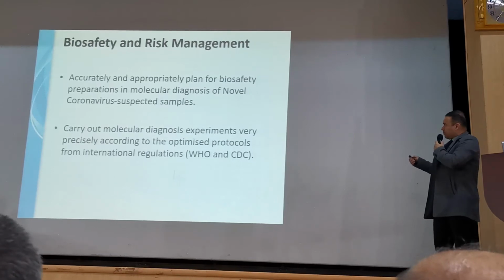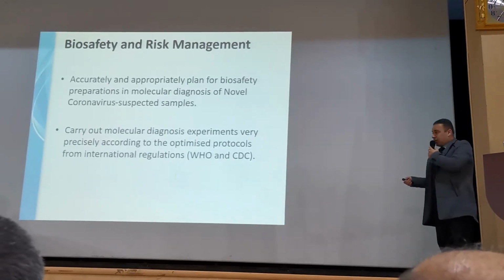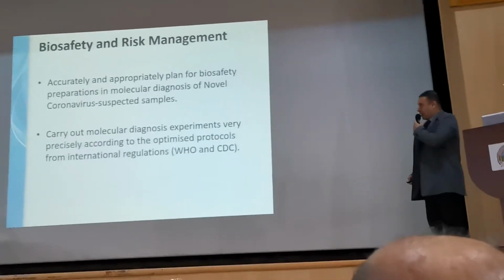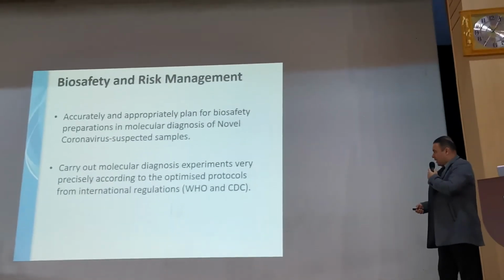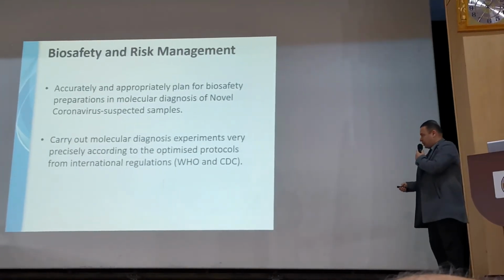I mean, for example, accurately preparing for the safety and processing of the sample inside the lab, and also doing the molecular diagnosis in a very precise way so as not to be another way for infection.